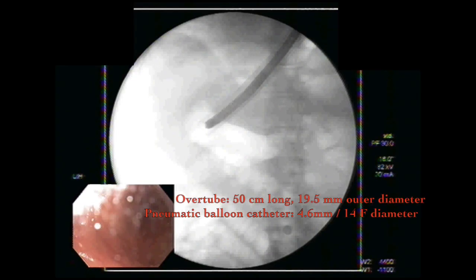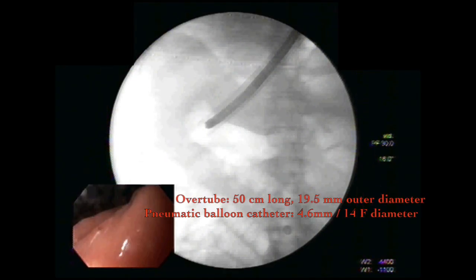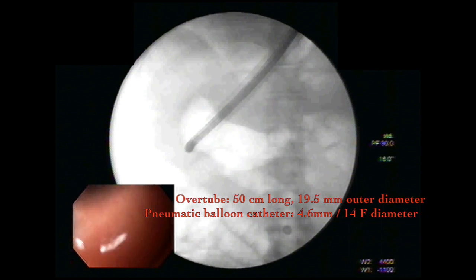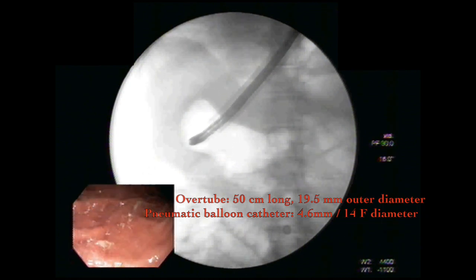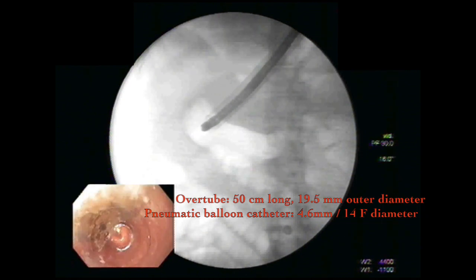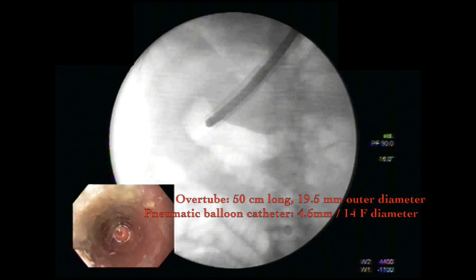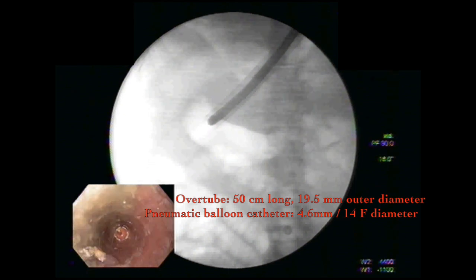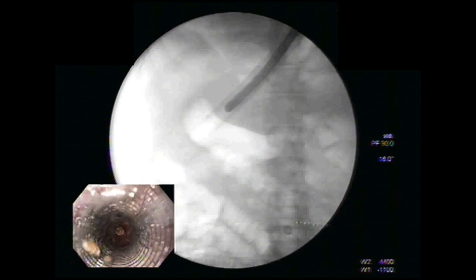A 50 centimeter long gastric overtube with an outer diameter of 19.5 millimeters is introduced over the scope. The overtube is introduced into the proximal stomach, and the scope is withdrawn.